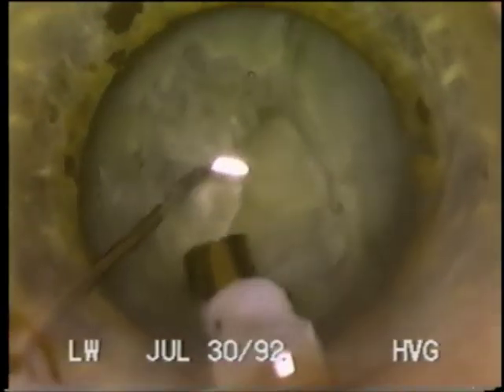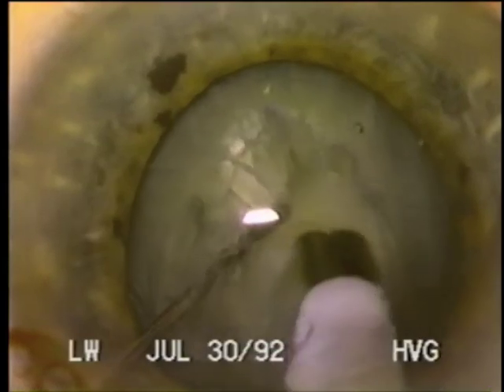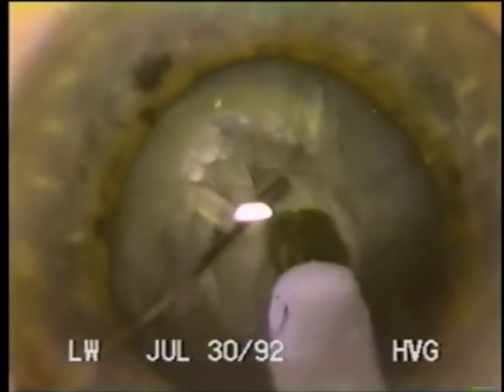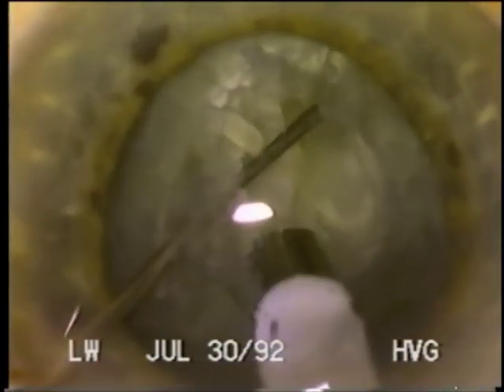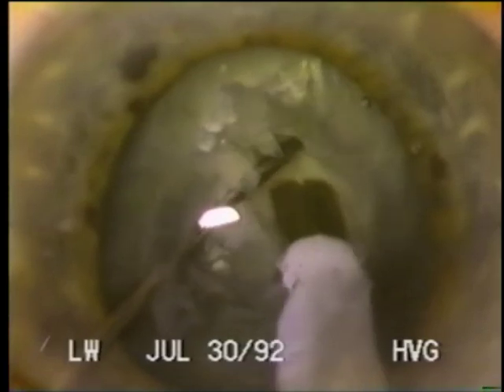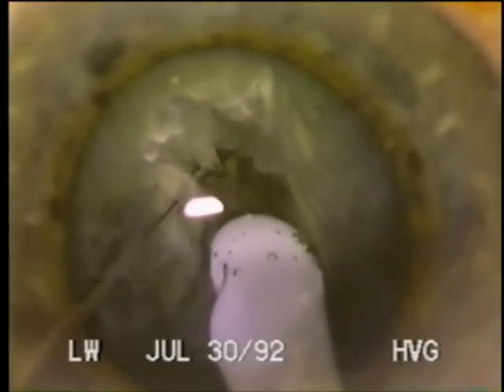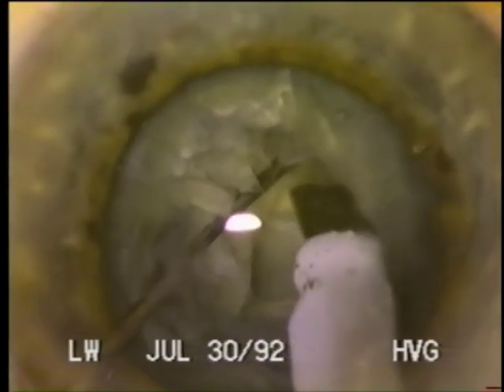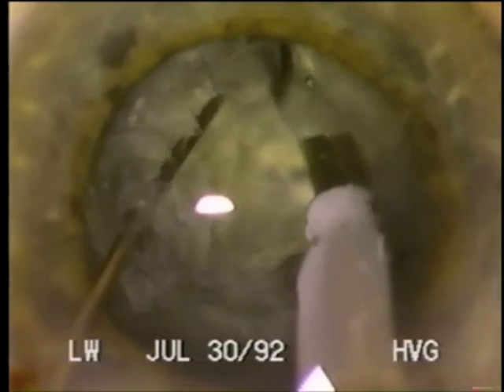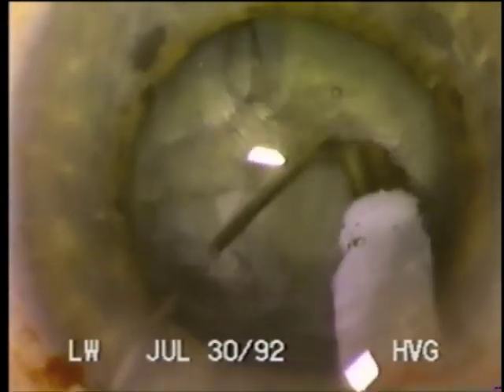Because this is a denser lens, time must be spent debulking the superior portion of it. A small trench is made with the phaco tip in order to give the second instrument a notch to push against for nudging the nucleus inferiorly. Once sculpted, the nucleus is nudged toward six o'clock. Sculpting is then accomplished in the superior portion of the lens, parallel to the concave posterior capsule. When attempting the first fracture of these lenses, either direct action fracturing or cross action fracturing — crossing the second instrument and the phaco tip over one another — can be used. Here the two instrument tips are placed deep in the center of the lens and a direct action fracturing method is used.